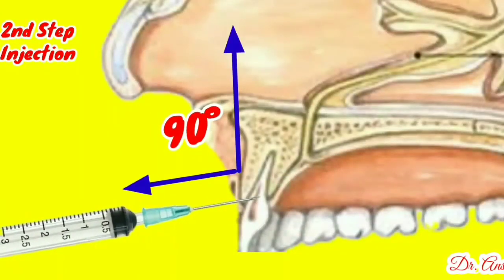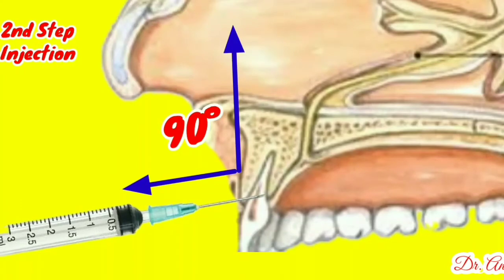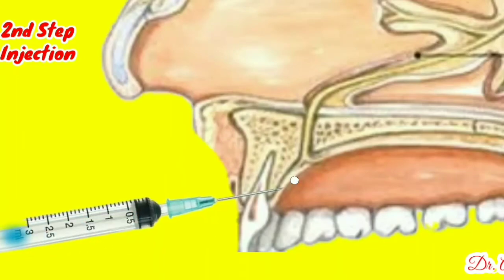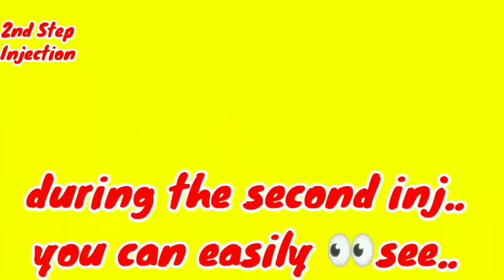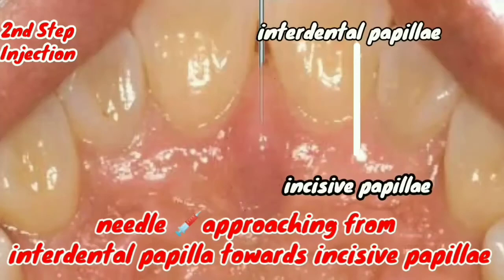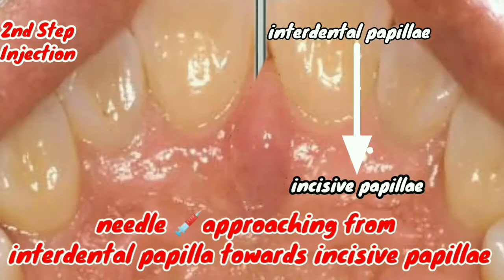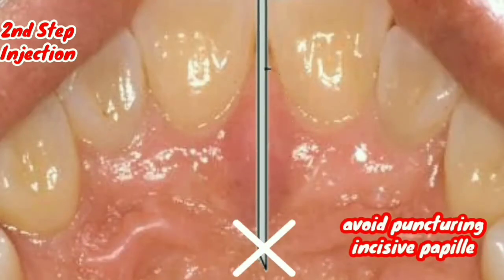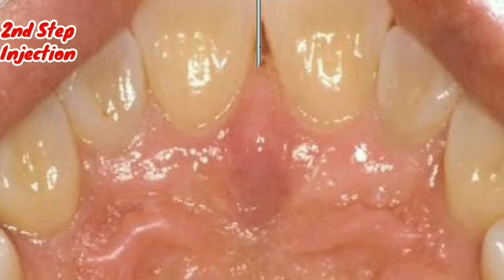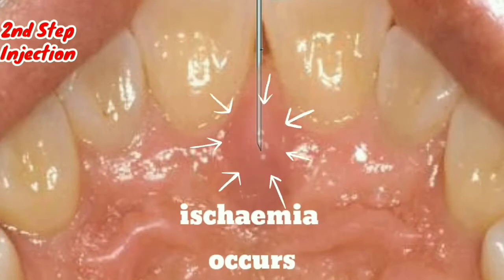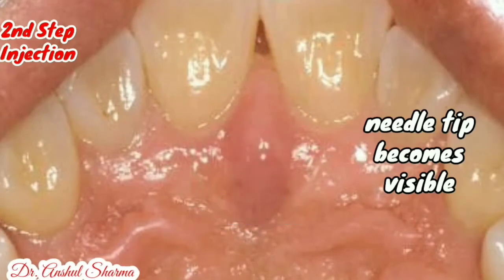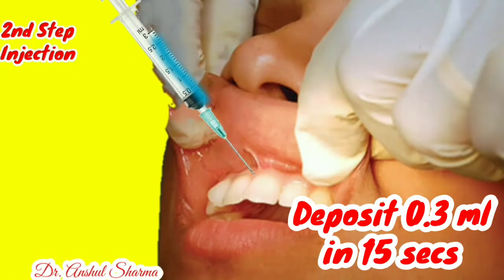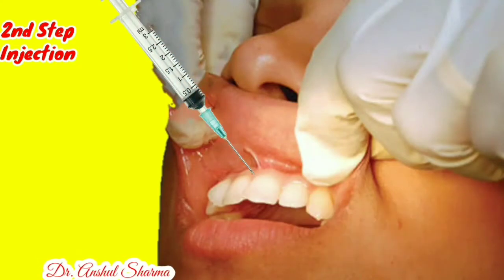However, as the needle penetrates towards the un-anesthetized palatal side, it will be necessary to administer minute volumes of solution to prevent discomfort. You can see the needle approaching from the interdental papilla towards and beneath the incisive papilla. Care must be taken to avoid puncture through the papilla into the oral cavity. When the needle has sufficiently reached below the incisive papilla, ischemia occurs and the needle tip becomes visible beneath the tissue surface. Perform negative aspiration, then deposit approximately 0.3 ml in approximately 15 seconds.